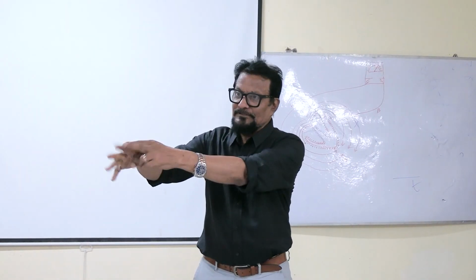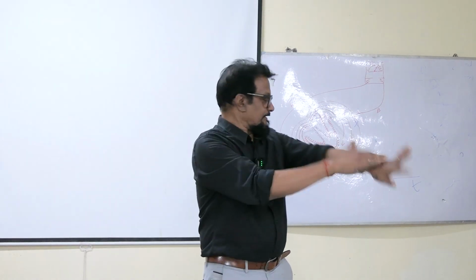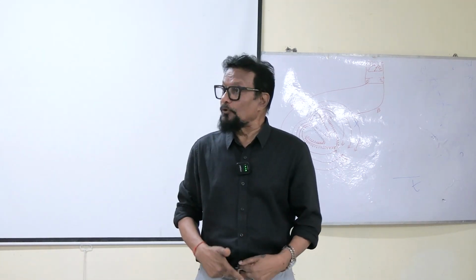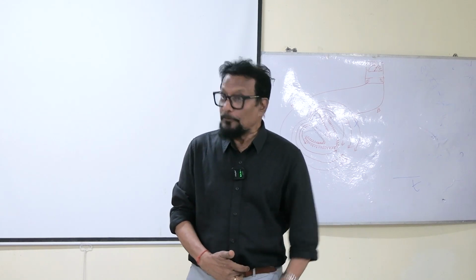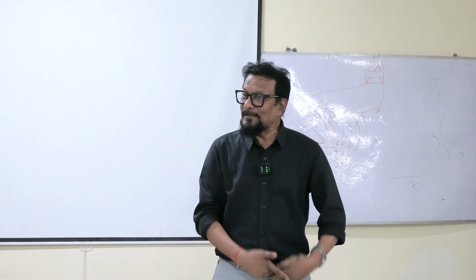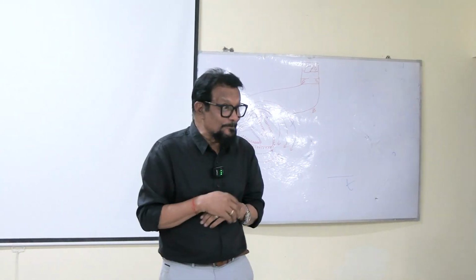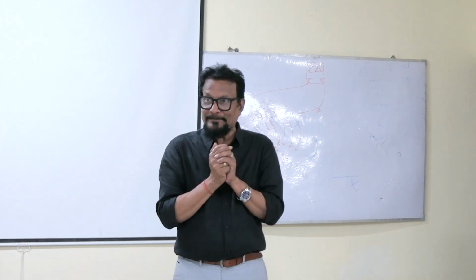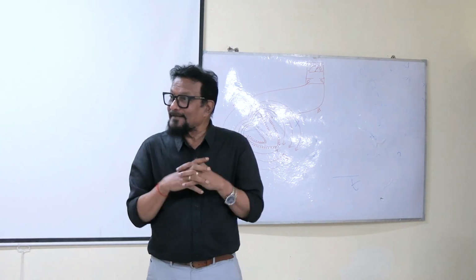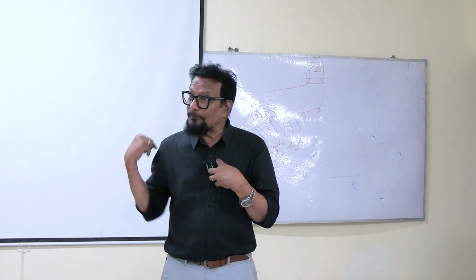The root of this limb is here, the acromion process, the root of this hand is here, and the root of this is the pelvic bone here, or the inguinal canal. Now I can connect all these three, and there will be an equilateral triangle. And you will observe that at the center of this equilateral triangle is your heart.